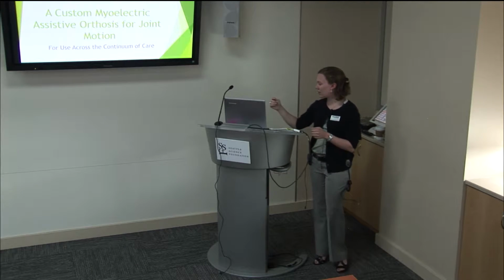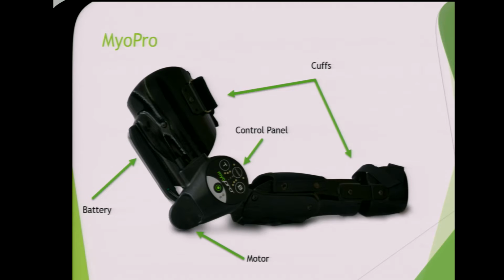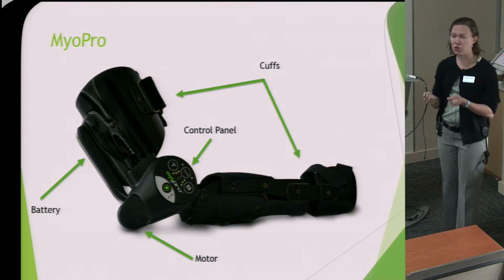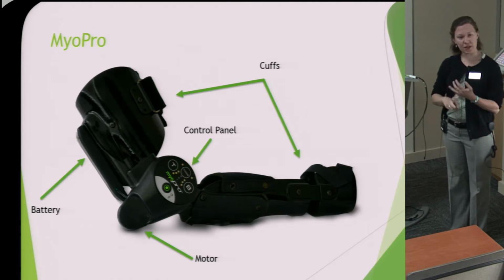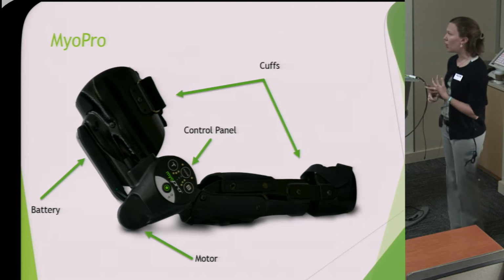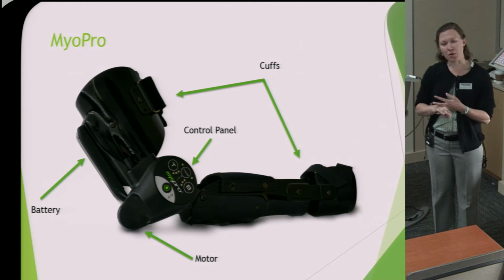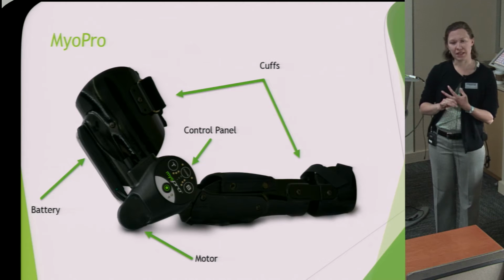But what we're talking about today is the MyoPro. This is a photo for you guys to look at. It is, like I said, custom designed, custom made, custom fabricated. So it's individualized for each patient's needs as far as the cuff size, the hand configuration. We are able to really get in there and do some unique things depending on the patient presentation.